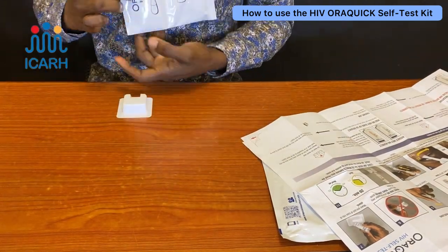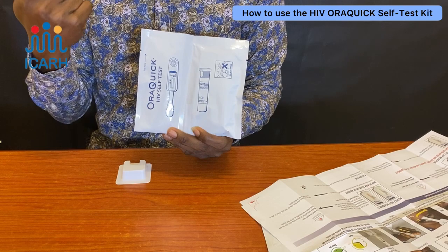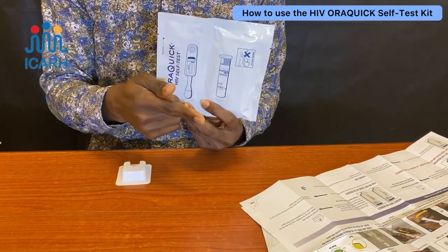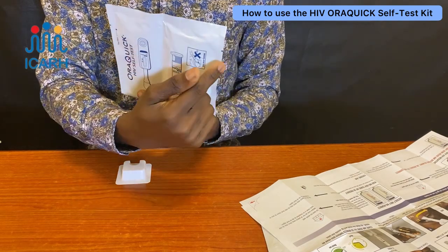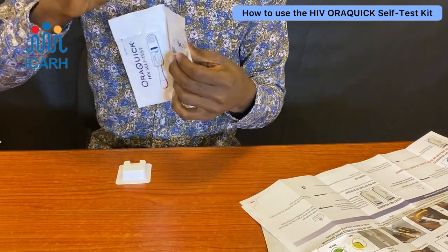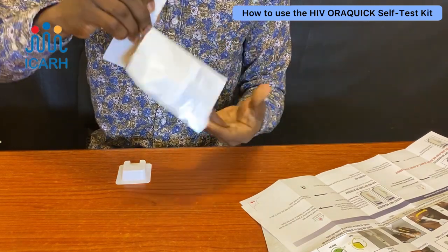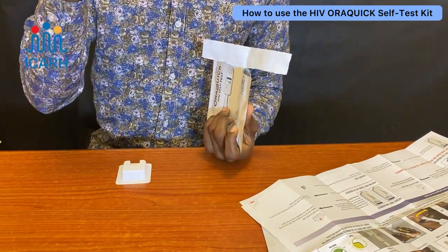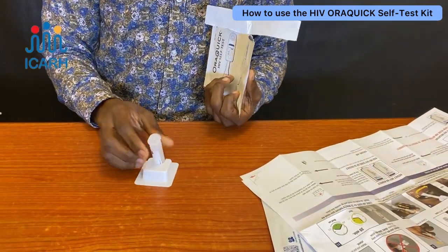The buffer is a liquid that actually reads the result of the test. Like the main box, the buffer packaging also has two edges to tear from. Please be careful when tearing — do one edge at a time as there are two items inside. First, bring out the buffer, then place it on the stand and pop it open.